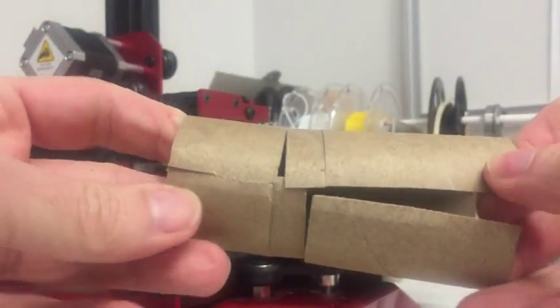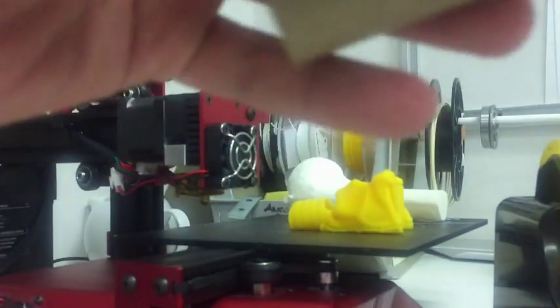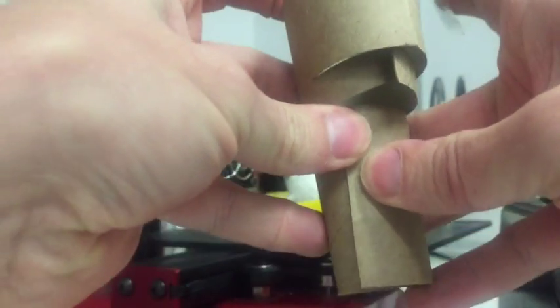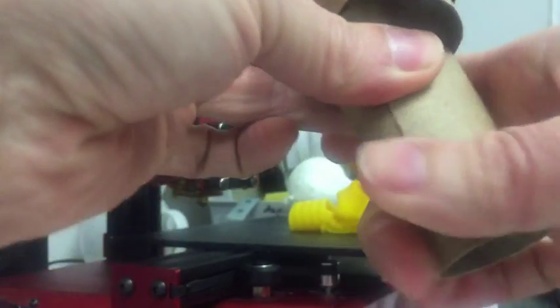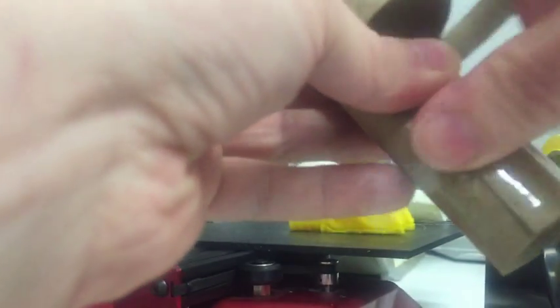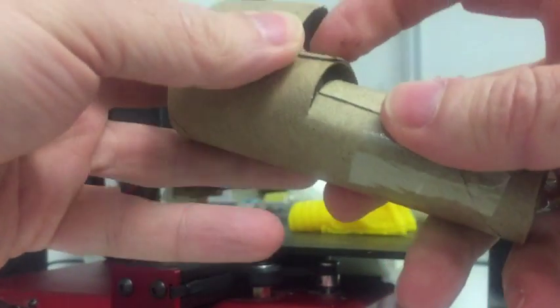So now we've made our cuts, time to get folding and taping. So I'll bring in a bit of sellotape. I don't know what you guys call it over there, sticky tape, sellotape. So we're going to take that cut that we've made, fold it right over, and tape it down. Hopefully this will stick properly. All right, and that ideally should be the trachea. It's a bit big, but I'm going a little fast here. Could take some time and do it properly.